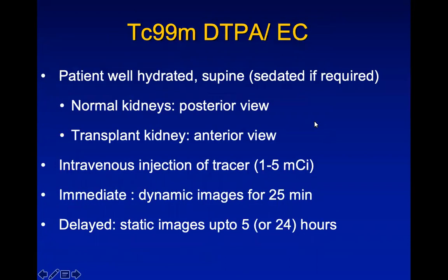So you have a well-hydrated patient who is put supine on the table. Sedation is only required in extremely uncooperative children. Any child over the age of 3 to 4 years, usually you can talk to them, convince them, or use very mild sedation if required. But properly prepared, the patients are usually cooperative.